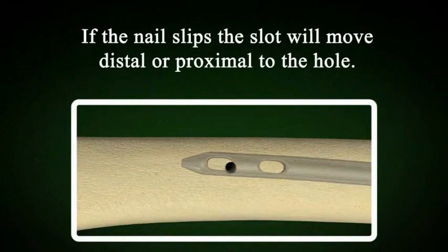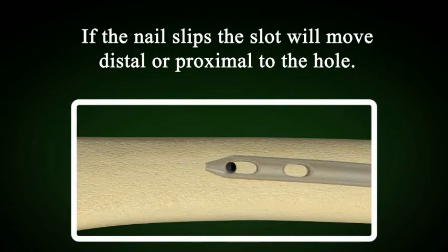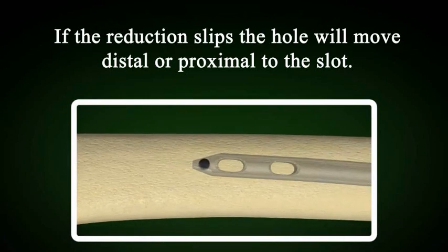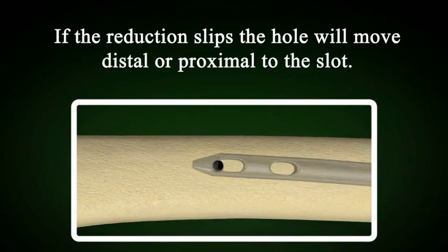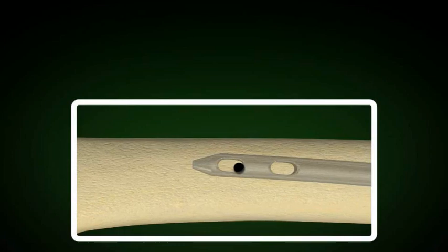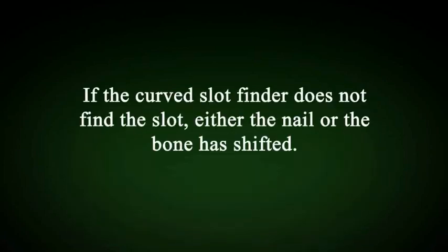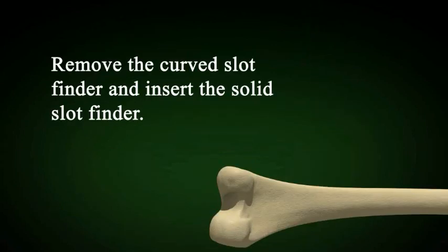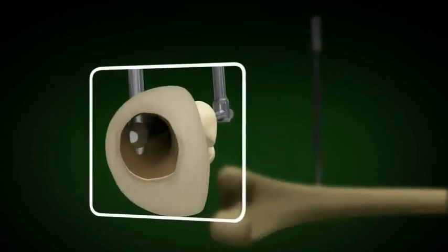Longitudinal slip is due to one of two things: either the nail has slipped farther into the bone, or the reduction has been lost and the bone has slipped. The hole will not align with the slot of the nail unless the longitudinal malalignment is corrected. If the curved slot finder does not find the slot, either the nail has slipped or the reduction has slipped. Remove the curved slot finder and proceed with the solid slot finder.